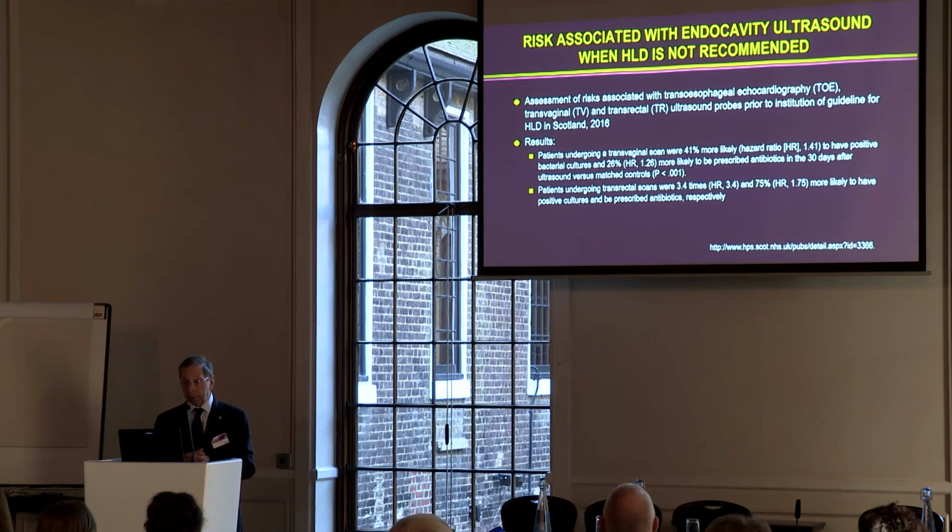Risks associated with endocavity probes when high-level disinfection is not recommended. This was a study assessment of risks associated with a whole variety of types of probes, transesophageal echocardiography, transvaginal, transrectal probes reported in Scotland. Patients undergoing a transvaginal scan were 41% more likely to have positive bacterial cultures and 26% more likely to be prescribed antibiotics in the 30 days after ultrasound probe versus matched controls. Again, showing you that this is really the tip of the iceberg.